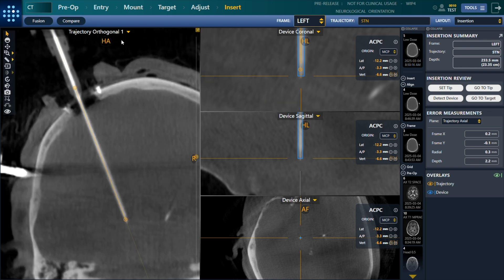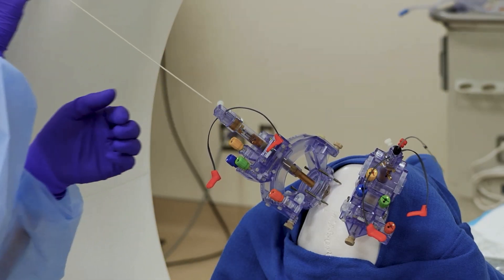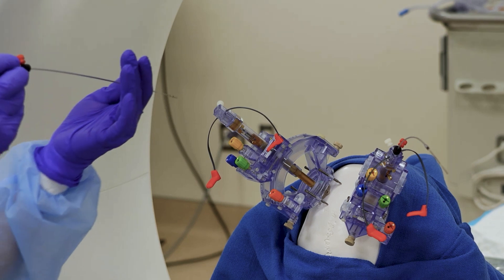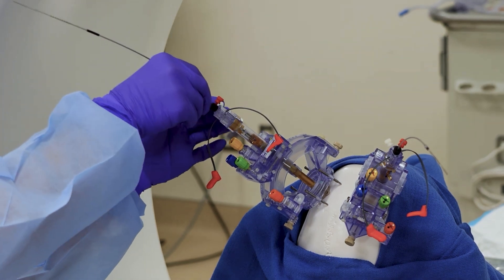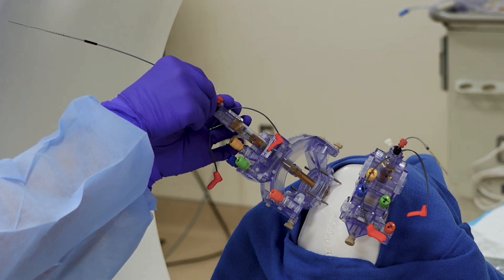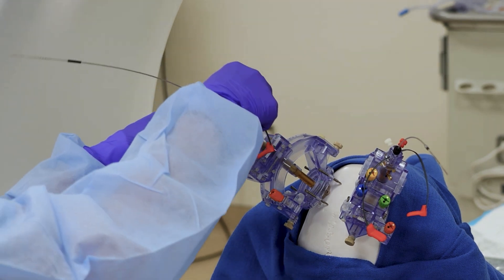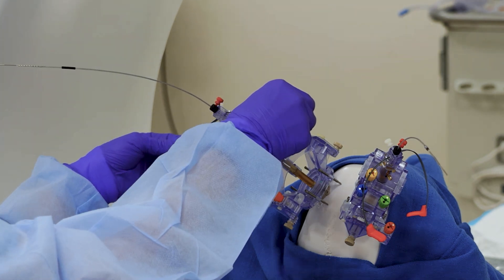After an image-based confirmation of placement, measure the DBS leads and swap out the ceramic stylets with the leads. The surgeon has the option to awaken the patient and evaluate symptom relief using macrostimulation. To finalize the lead placements, the peel-away sheaths are removed leaving the DBS leads in place.